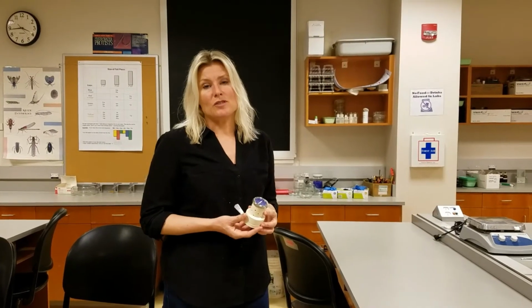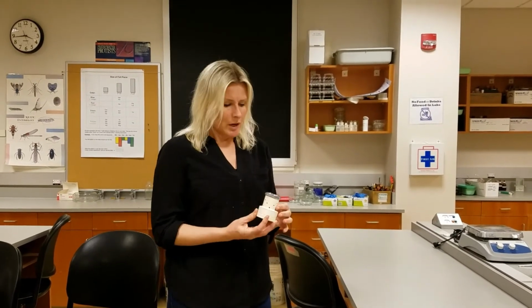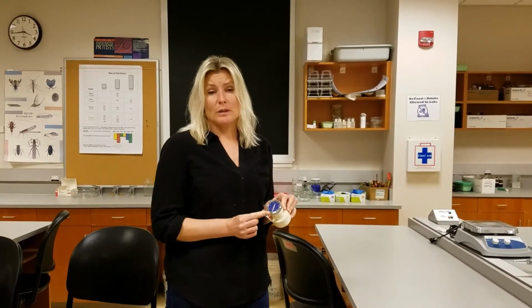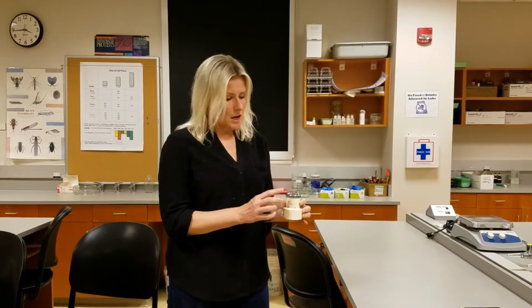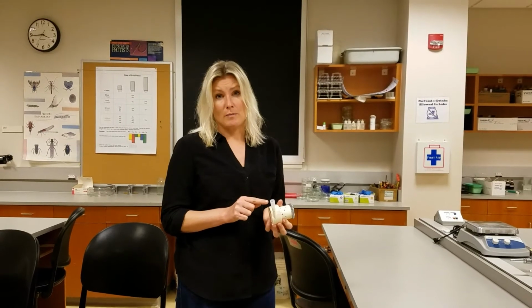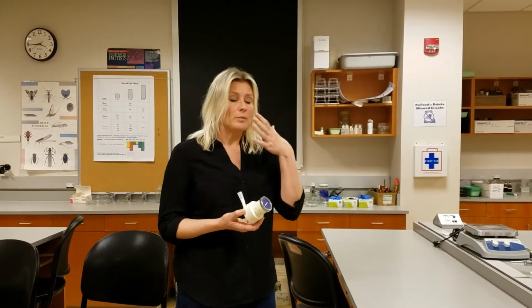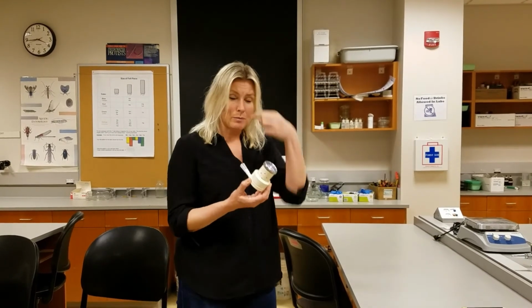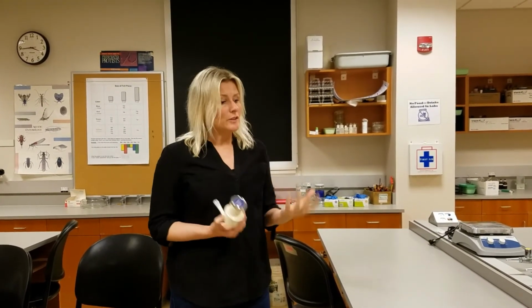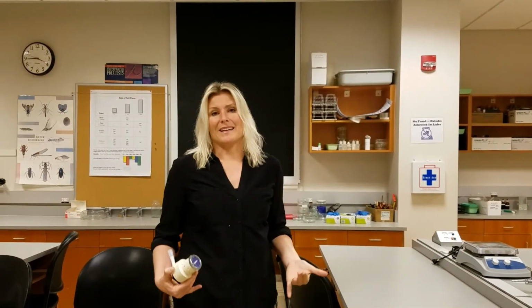So I'm going to demonstrate a vital capacity using one of these spirometers. I made sure I have zeroed out my dial here. The next thing I need to think about is getting a good seal around the mouthpiece. I need to pinch my nose, or if you have a nose clip, that could be a good thing too, but I'm going to pinch my nose at the same time. When you're doing vital capacities and these volumes, you should be standing up.